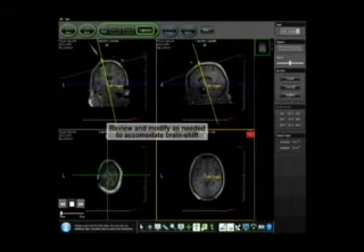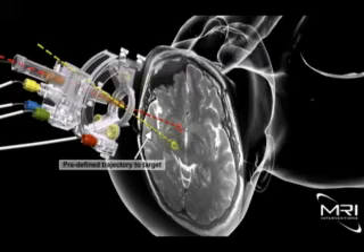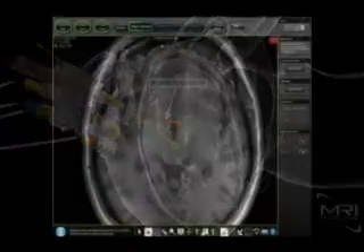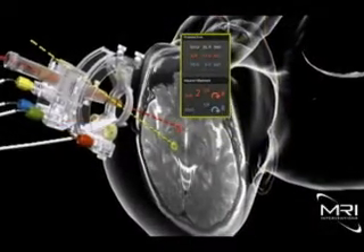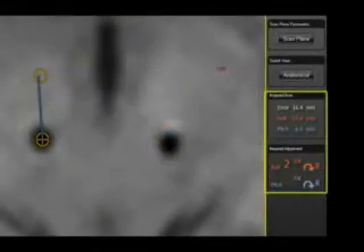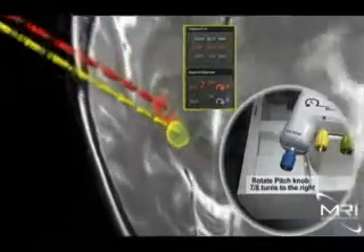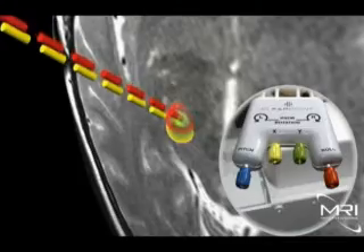With the smart frame and patient anatomy in a common 3D imaging and surgical space, the interventional portion of the procedure is simple. The ClearPoint system is aware of both the planned trajectory and the smart frame trajectory. The software then guides the surgeon in the adjustment of the smart frame controls — adjusting and observing the roll of the smart frame by turning the red knob to the right, then adjusting and observing the pitch by turning the blue knob to the right. A precision adjustment is then performed with the yellow X and green Y knobs to complete the alignment.